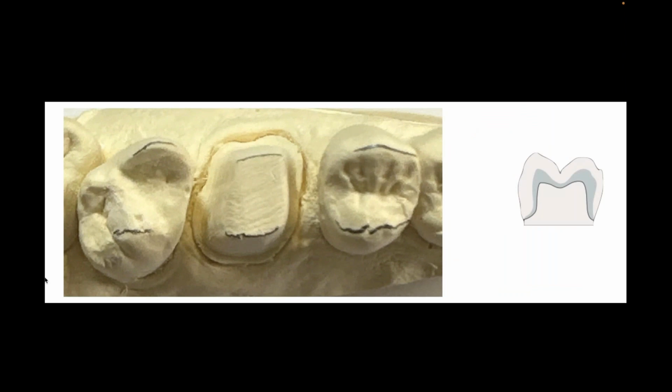I can't tell you how many times I just grabbed this out of my text. I just sent that to a doctor a few days ago. He asked me how his prep was. I said, your prep is wonderful. Look at all the nice detail. Look how clean your margin is. Look at the cord pack. But what did you miss? You missed the occlusal table. Look at the occlusal table here, and look at the occlusal table on this prep. And by the way, that line is generous because it's really a little bit more over here, right?